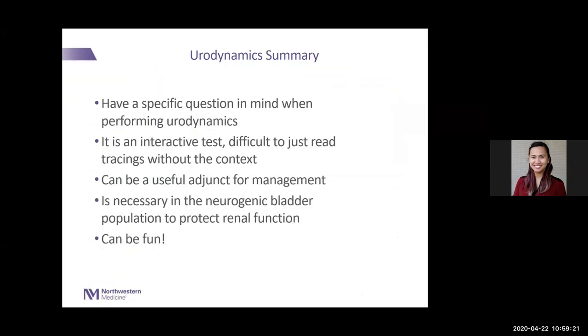I'm going to stop for some questions, but just remember, with urodynamics, have a question in mind when you're doing them. Make sure it's something that's going to change your management. It is an interactive test, you can't read the tracings without context. It can be a helpful adjunct. It's not always necessary, but in your neurogenic population, it's important for their kidneys.